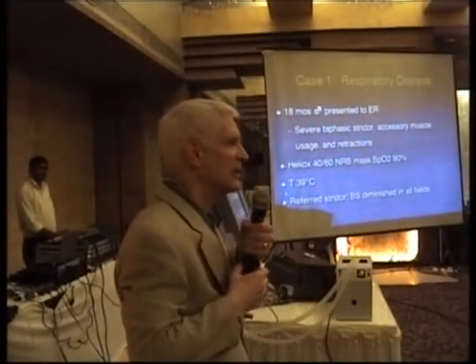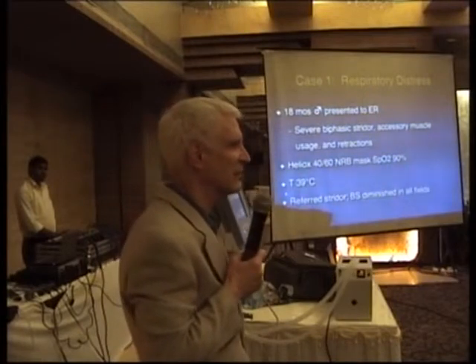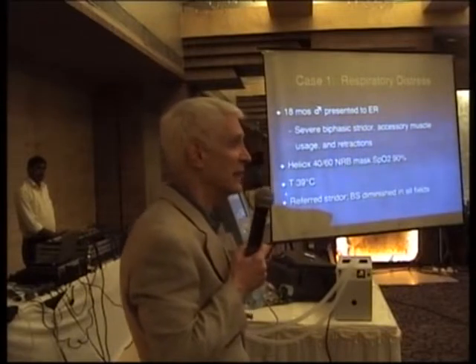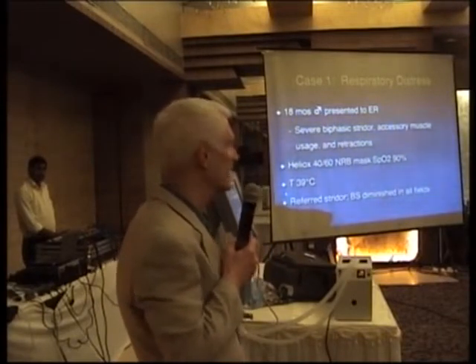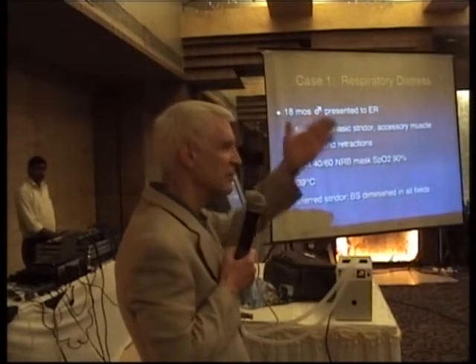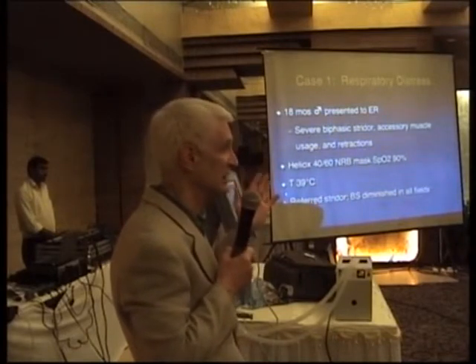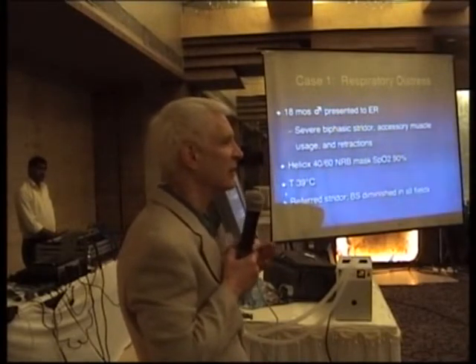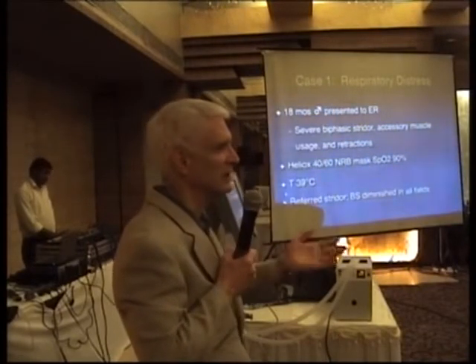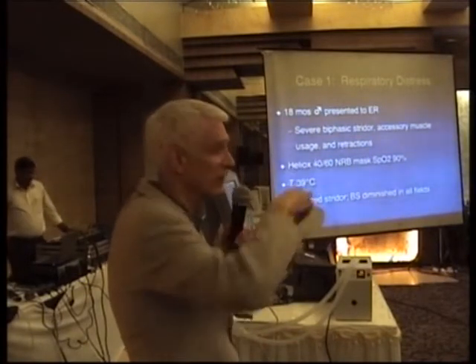Asthma. Asthma is the correct answer. Patients with asthma have obstruction during inspiration and expiration, but predominantly during exhalation, and it's the same type of graphic, with an even sharper decrease in flow at the end of exhalation. And in that instance, not this one, but in that instance, you give albuterol, and the patient will change the shape of that curve to an oval.